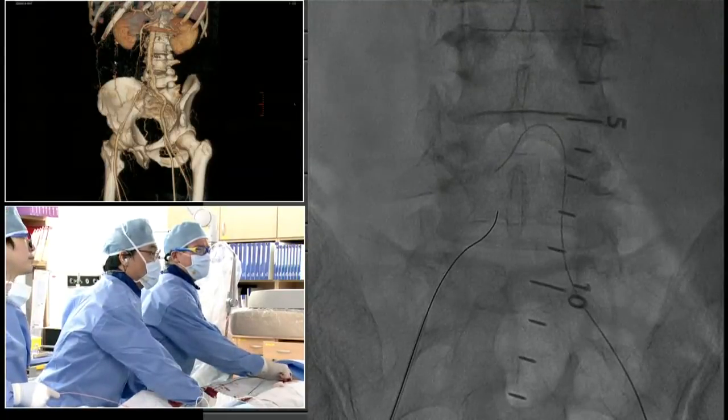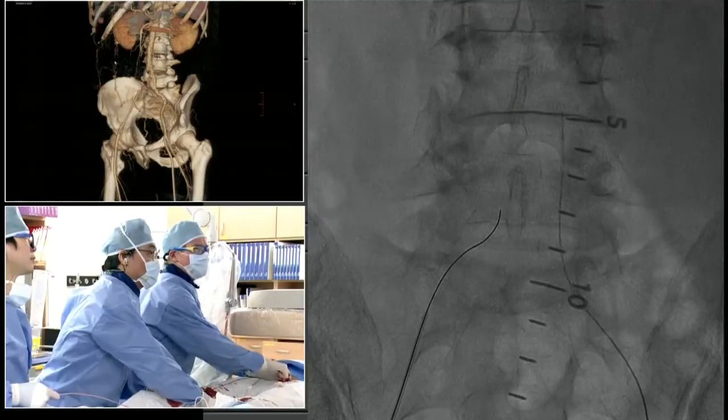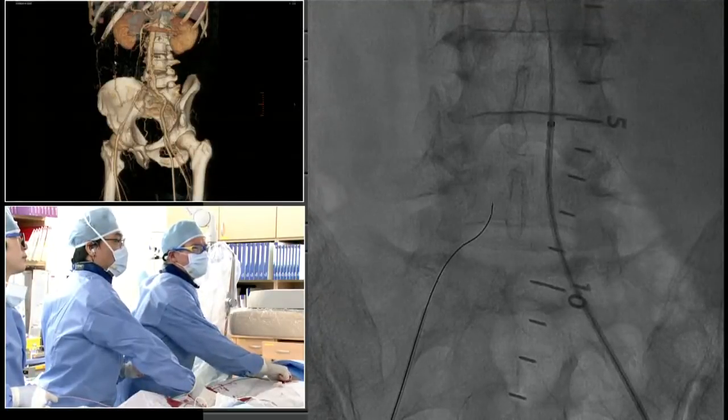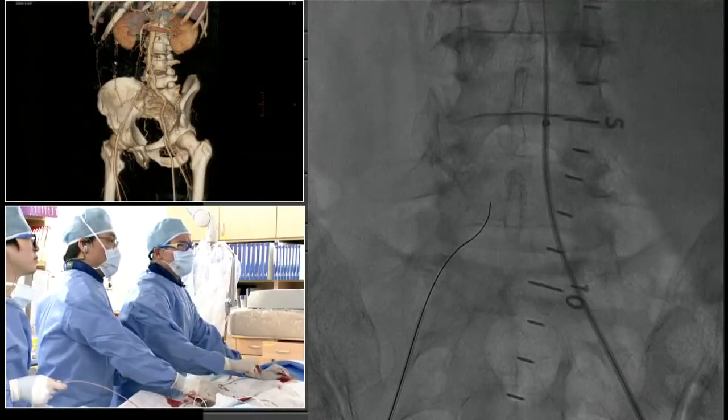I have to say these are my absolute favorite cases. Iliac CTOs. Oh, darn it. Okay, well. Fun to do. That's fine. We'll go back high up to the Omni. Success rate, durable results, patients feel great. Yeah. Really, they're a lot of fun to do. Let's go up with that Omni I think then.